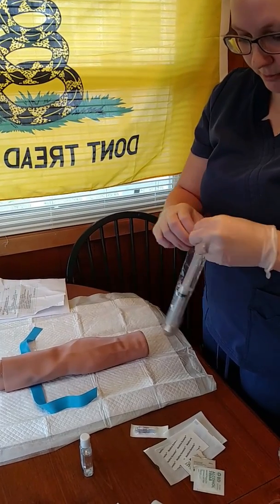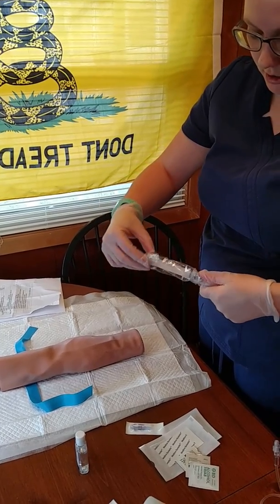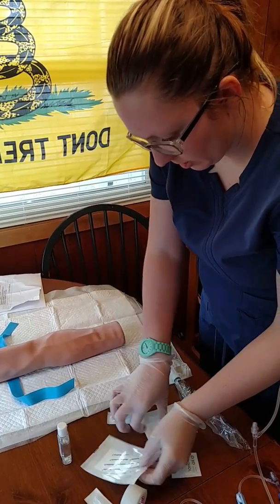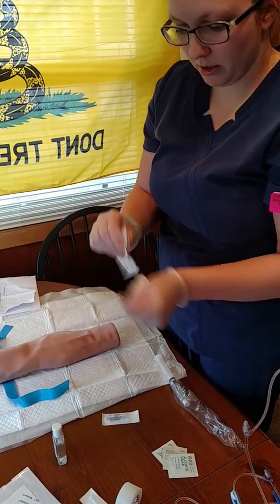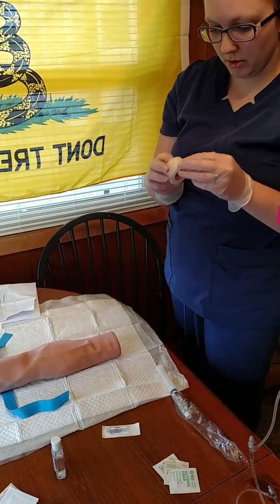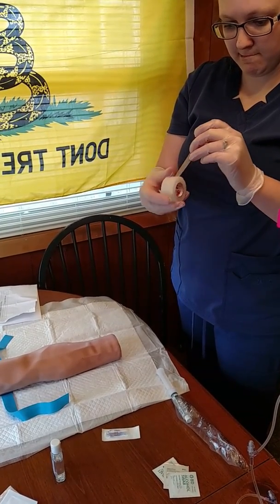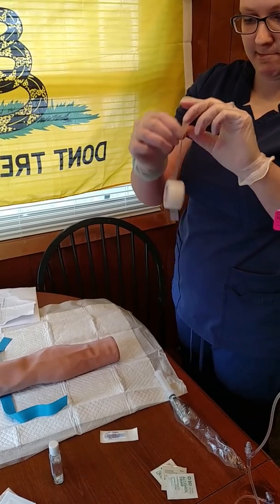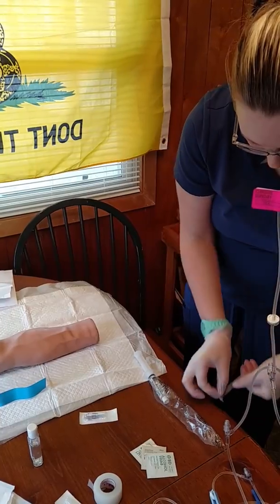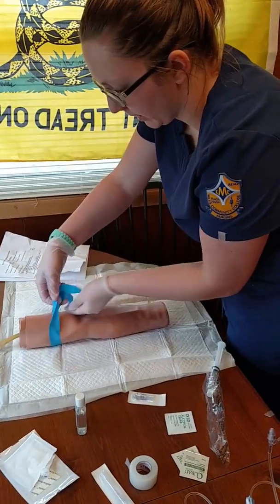Get everything set up here so I don't take too long after we get her poked. Okay, I think we're ready to go here.